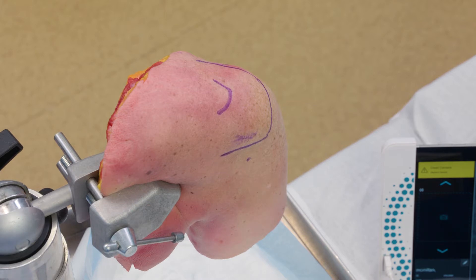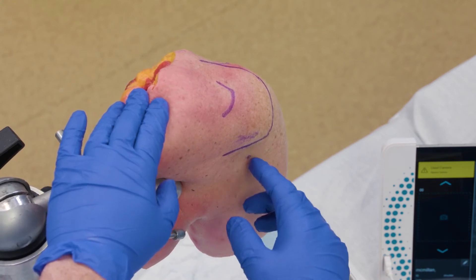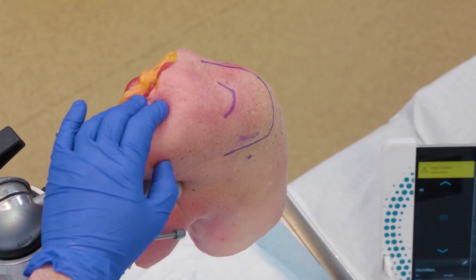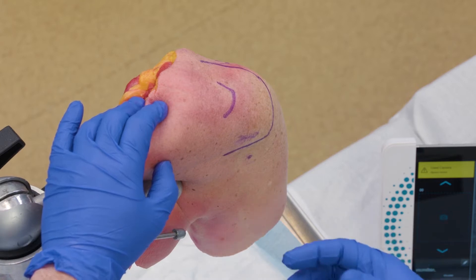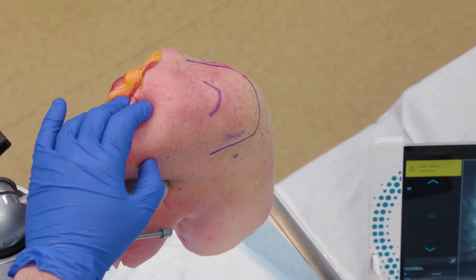I'll do about 1cc skin wheel right at the posterior aspect of the shoulder where my soft spot is. Then I'll come around to the front of the shoulder and mark out where I think I might come through the rotator interval, and inject a big skin wheel there as well in case I need to come through with an 18-gauge needle to palpate something.